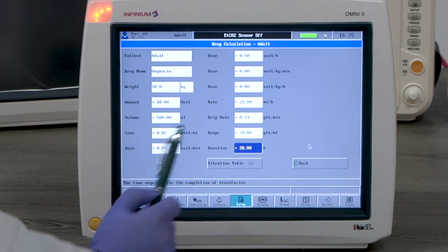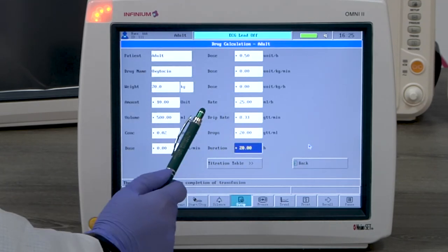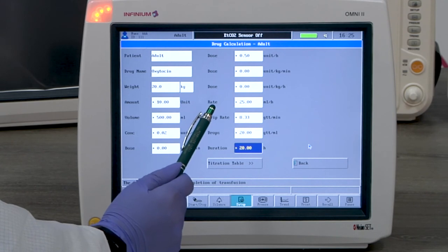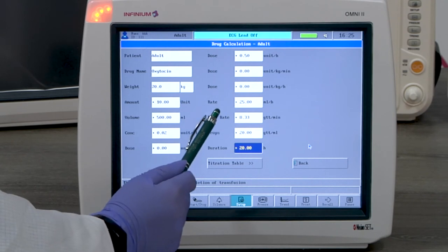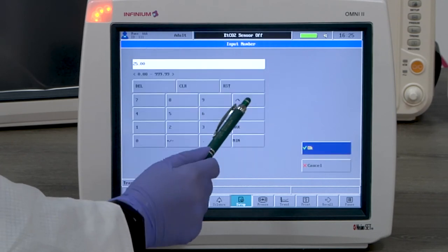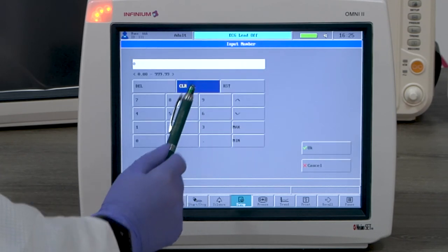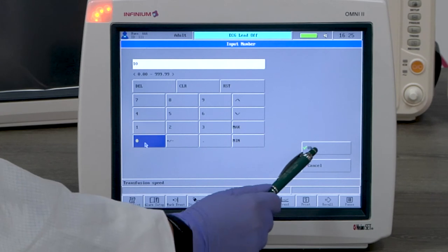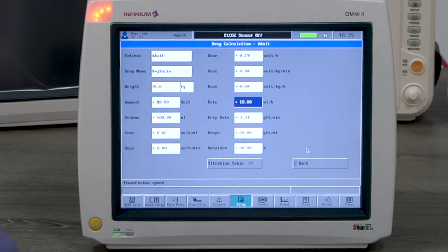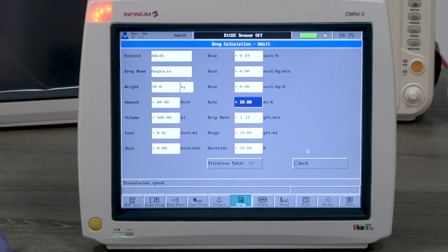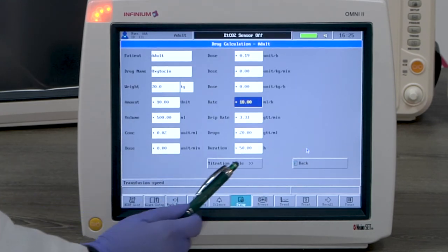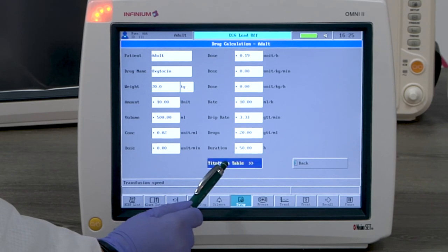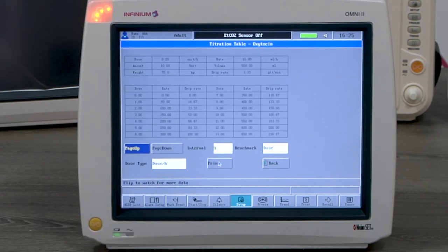You'll see all the related calculations have been populated. If you want to change one certain parameter, for example, the rate needs to be set at 10 milliliters per hour, then all numbers will be recalculated accordingly. Once the numbers are input, you can go to titration table.